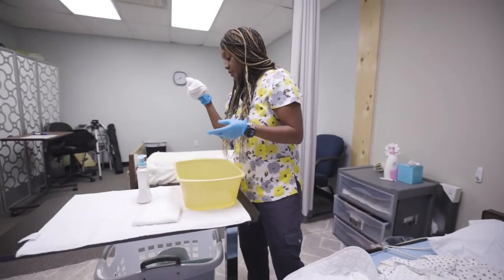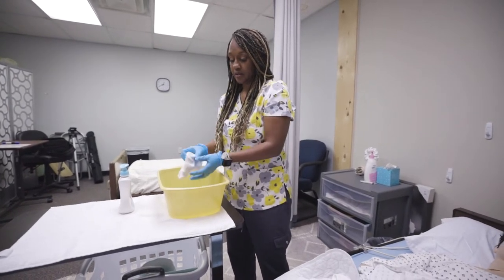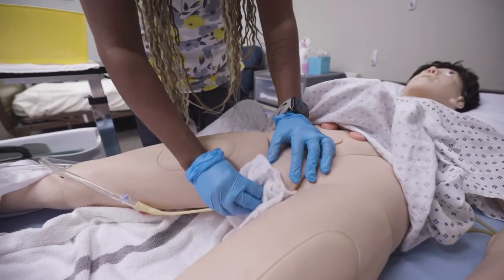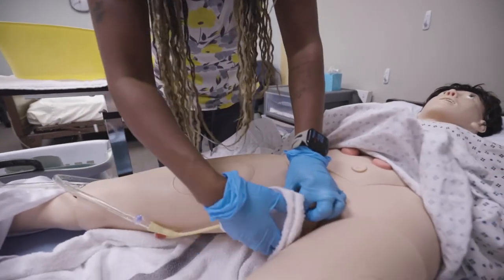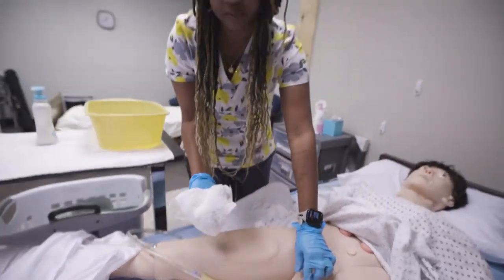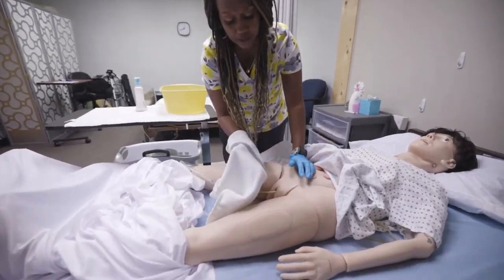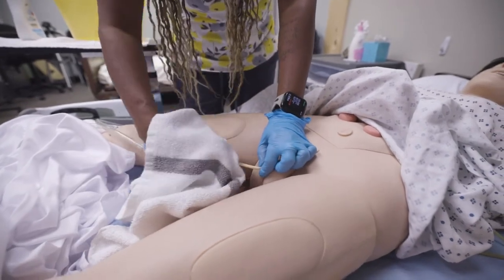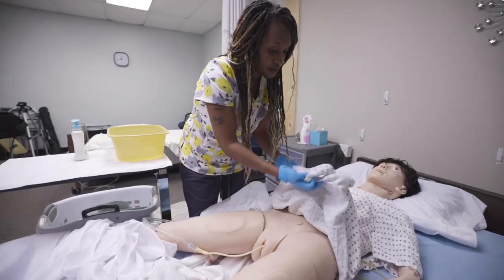Get rid of the wash towel and now rinse — dab dab to remove excess water. Do the same steps: spread the labia, go down one, go down two — that's two sides of the towel used. On the third side, hold the catheter, wrap around and go down. Now for drying: use the barrier slash dry towel, pat the middle, then hold the catheter and squeeze to dry it thoroughly.